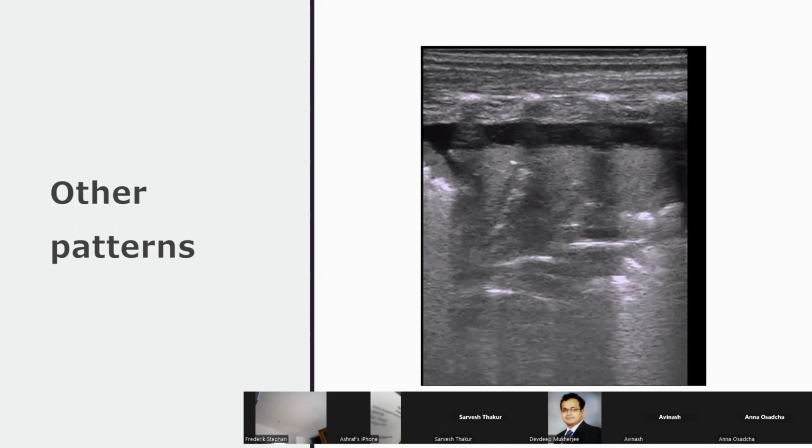Naturally, if you look at all those mechanisms, the effect on blood pressure will be more for certain things and less for something else. So a lot of people in this situation, with a baby who's got low blood pressure, would maybe try positioning first without doing the recruitment maneuver to see if it improves things. And assuming that's the left lung with the whole of the lower lobe gone, you might just want to keep the baby left side up as opposed to doing the recruitment maneuver.